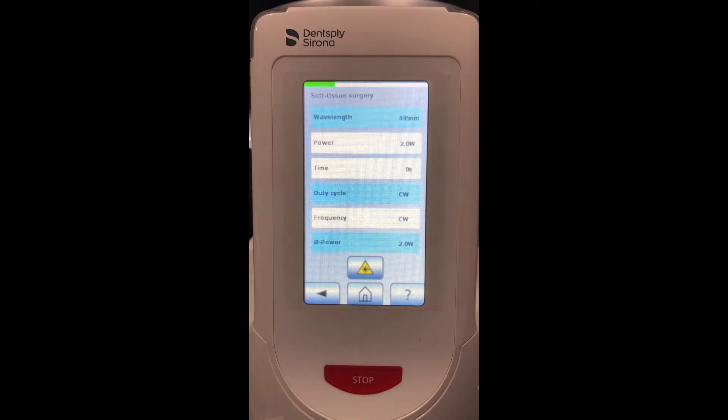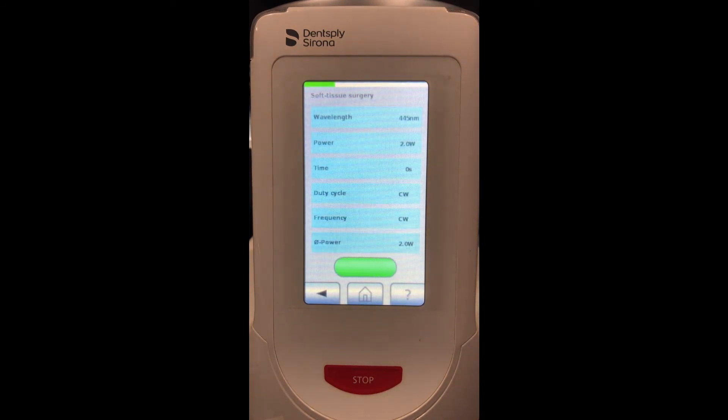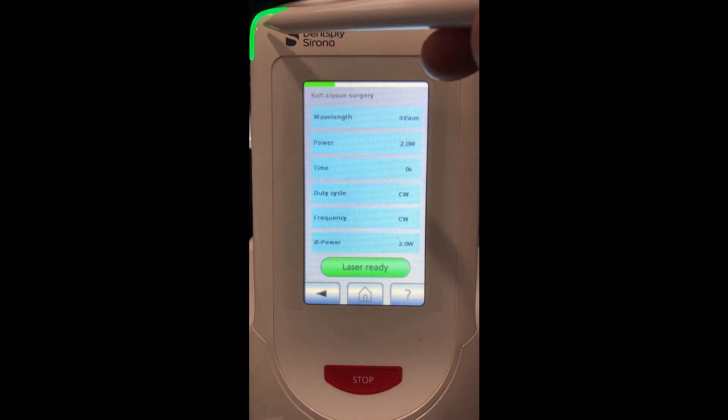When we want to pick a procedure for a patient we would click on it, then to activate click the yellow triangle in the middle. It will ask us to put our goggles on — click OK. A few things to notice here: this green bar at the bottom of the screen says 'laser ready,' as well as lights at the top of the actual laser itself.